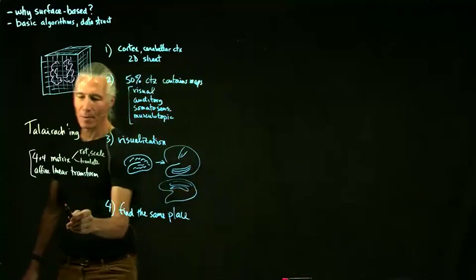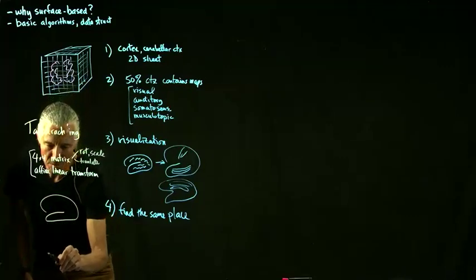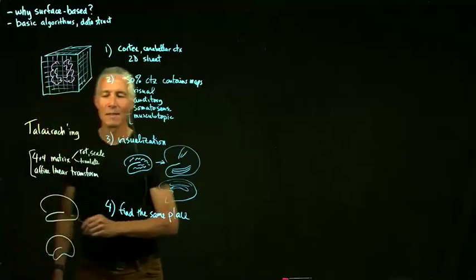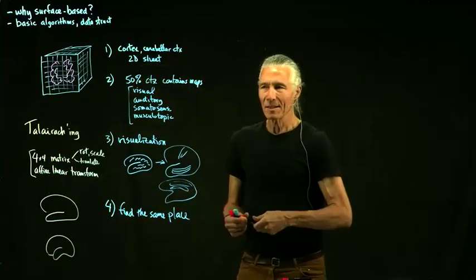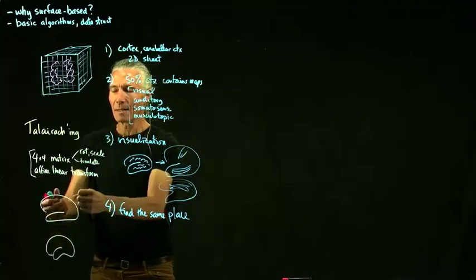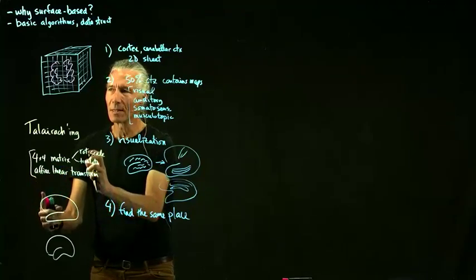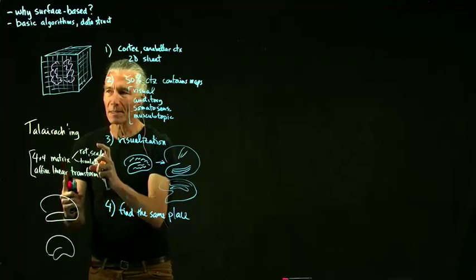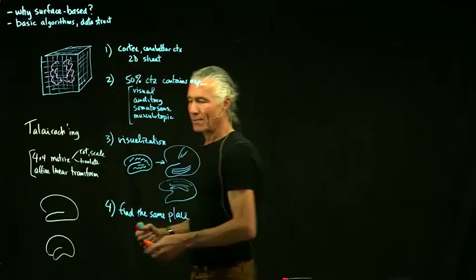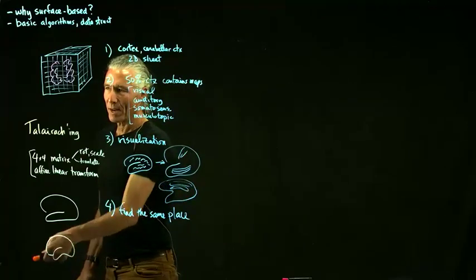And so if you have one person's brain that looks like this, and another person's brain that looks a little bit more like that, that's a bend. That's not a linear transformation. With a linear transformation, you can stretch, or you can rotate, or you can shear, like turn something into a rhombus. But you can't bend. You can't make this part of the brain go up and that part of the brain go down and that part go down on the other side.